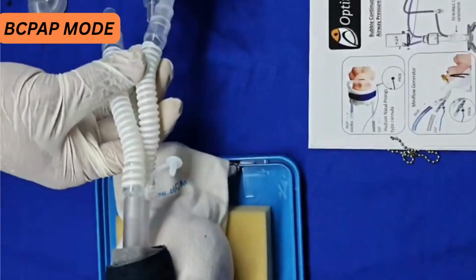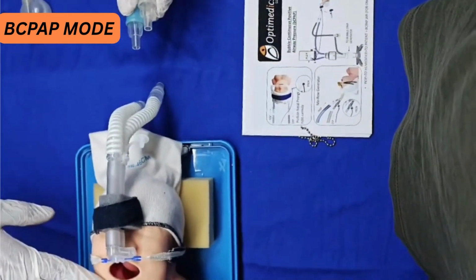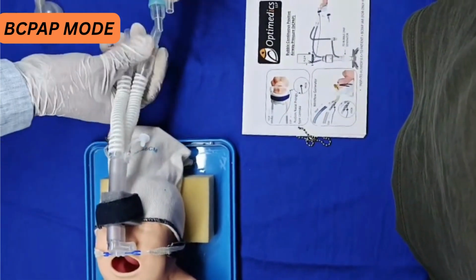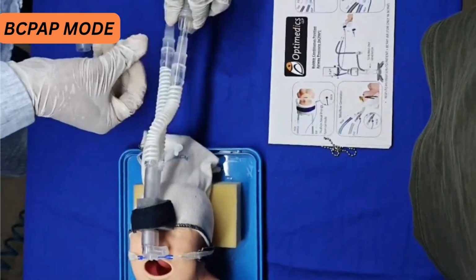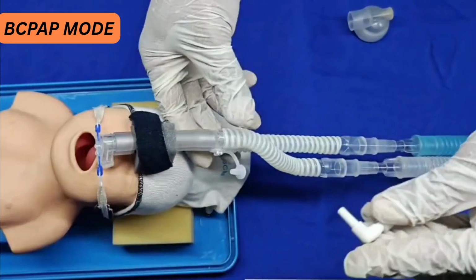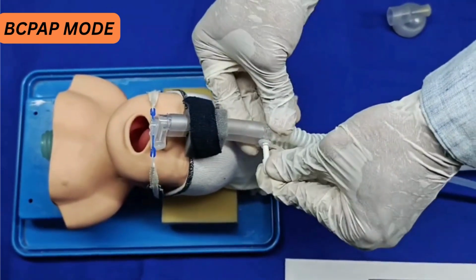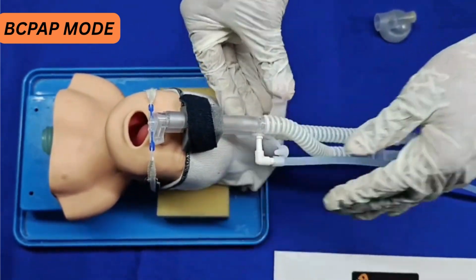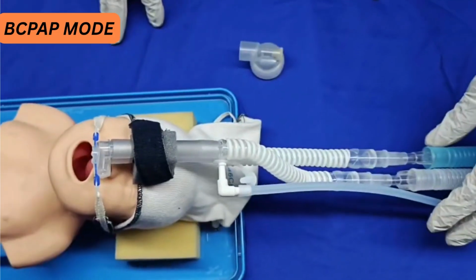This is BC191 nasal interface that is attached with this baby, as you can see. Now I am going to attach this inspiratory and expiratory limb here and this proximal pressure line in the proximal pressure port. Now we have connected the interface with the ventilator circuit.